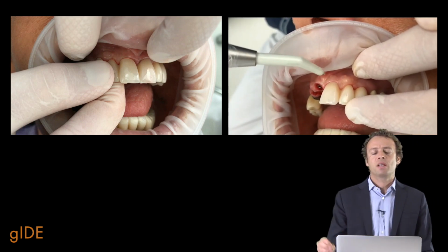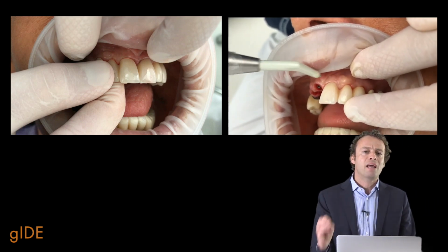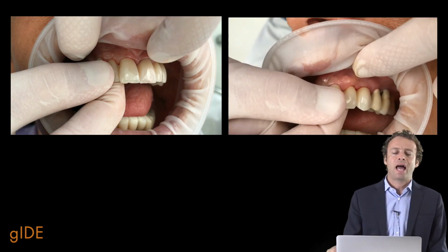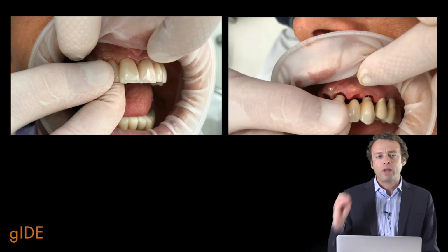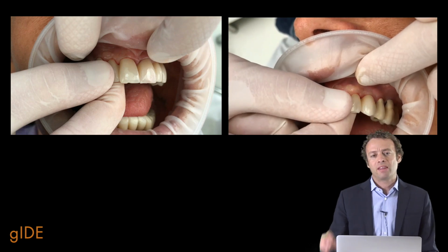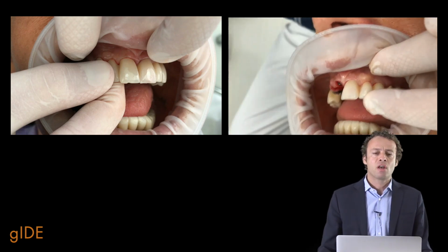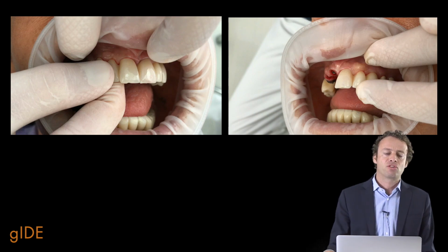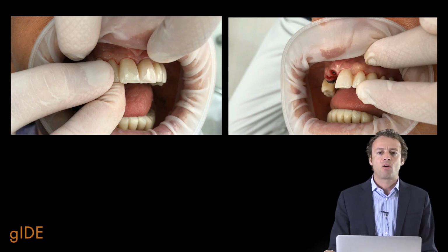And this for me is a crucial aspect also in terms of reliability, because when I can, I always like not to drill the zirconia intraorally after the sintering process, because of the risk of overheating the framework and the risk of creating fractures and cracks inside the zirconia.